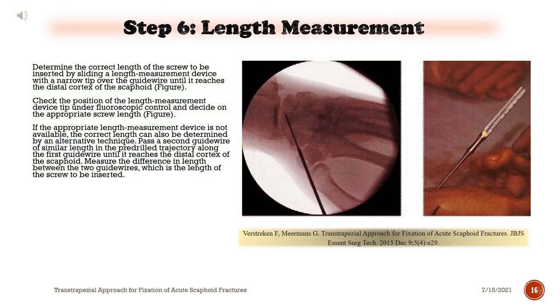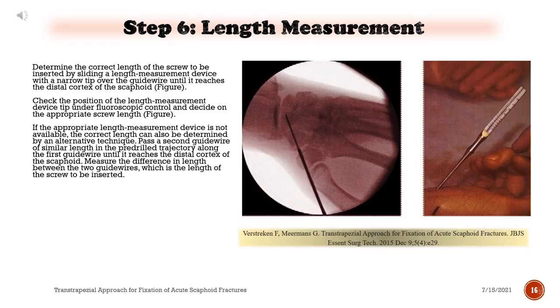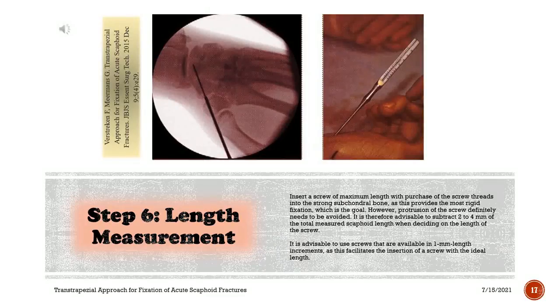Step 6: Length measurement. Determine the correct screw length by sliding a length measurement device with a narrow tip over the guide wire until it reaches the distal cortex of the scaphoid. Check its position under fluoroscopic control. If the appropriate device is not available, pass a second guide wire of similar length along the first until it reaches the distal cortex, then measure the difference in length between the two wires. Insert a screw of maximum length with purchase of the screw threads into the strong subchondral bone, as this provides the most rigid fixation.